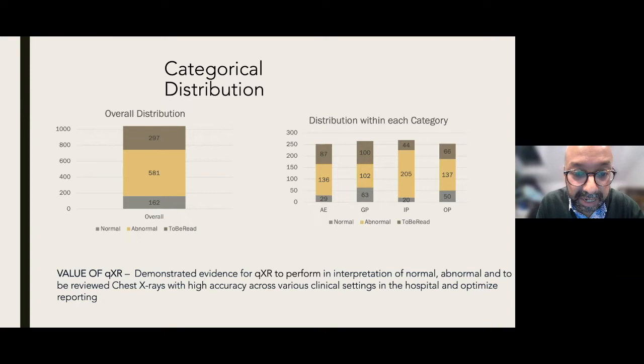Now, at the moment, if our radiologists aren't looking at them, we're not spending money on them looking at them. But now we're going to have to spend money on them looking at 85% of the x-rays. So it's not actually a cost saving. So therefore, should we just not bother with the chest x-ray AI and just spend the money on the radiologist looking at all of them, because you're only going to save 15%? But on the other hand, 15% out of hundreds and hundreds of thousands of x-rays is actually quite a lot.